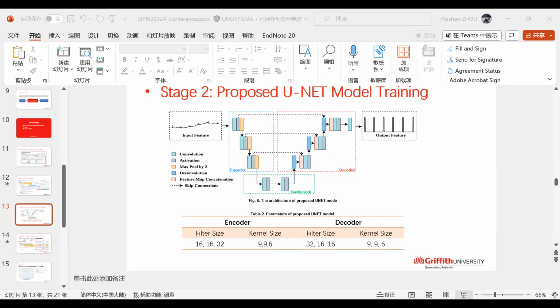3 metrics are used for model evaluation, and a matching window we show here is used to decide whether the prediction should be considered as a true positive, false negative or false positive.